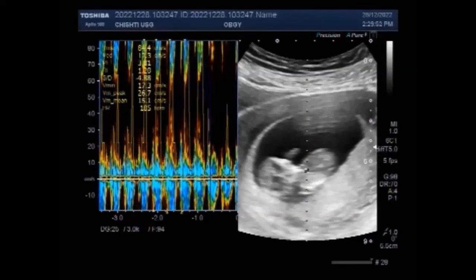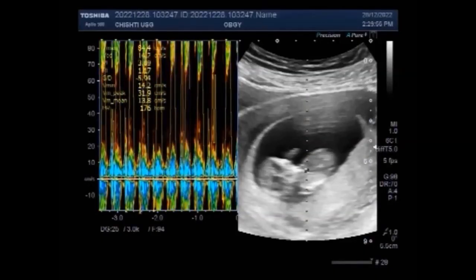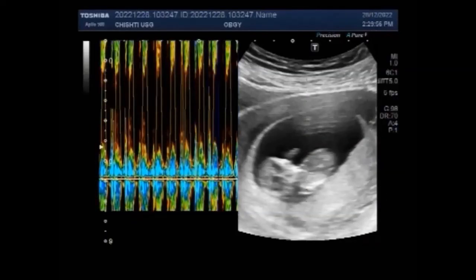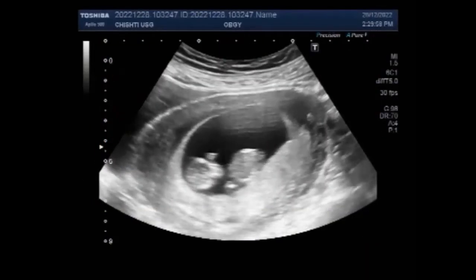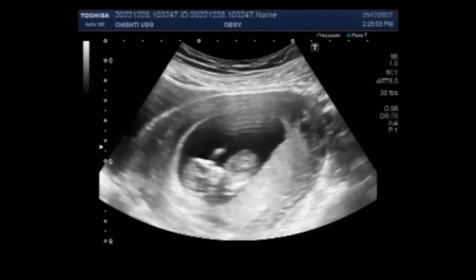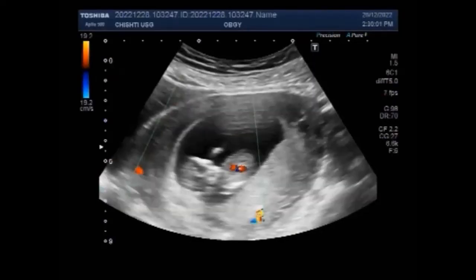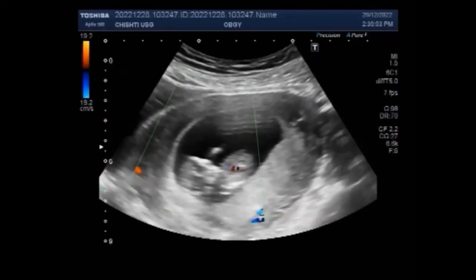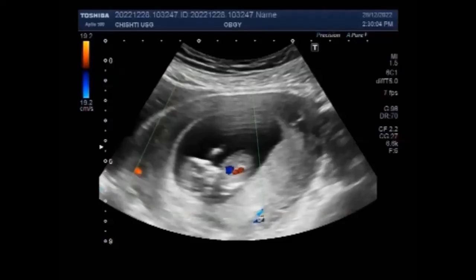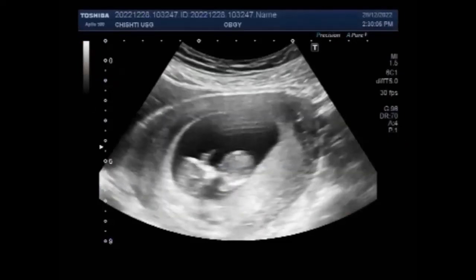You can see the normal fetus has fetal cardiac activity, fetal movements, blood flow, and is echo-morphologically normal.